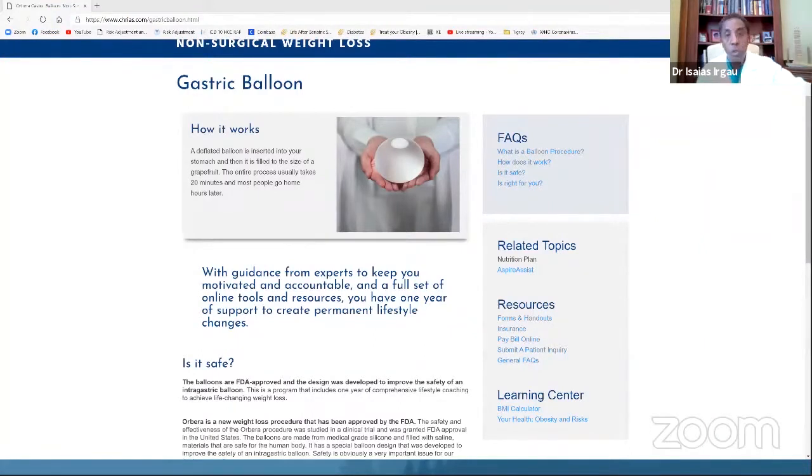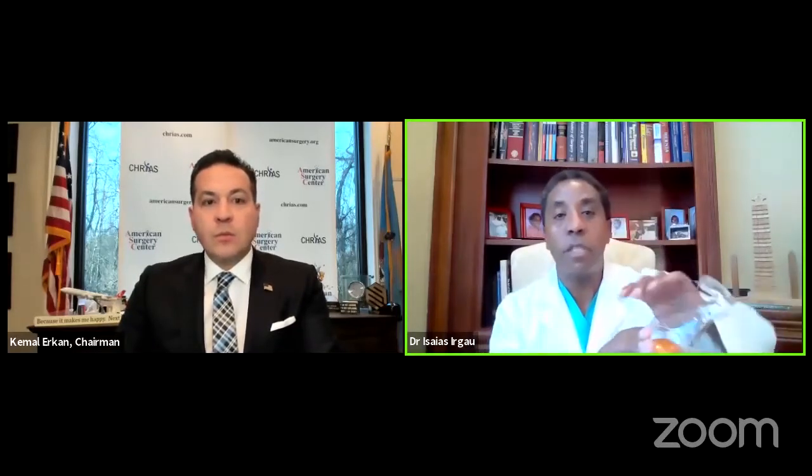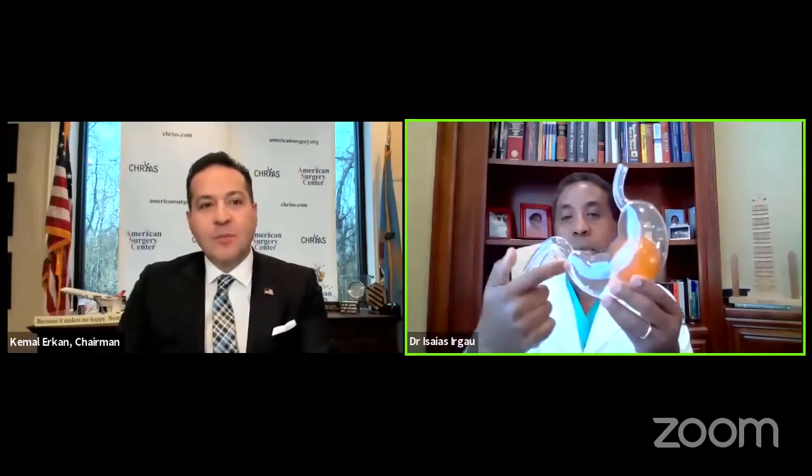I have one sample of the balloon here in my hand. That is actually the Orbera balloon. It's a good size, has some weight, and it enters the stomach deflated. To demonstrate a little bit more, I have this desk model — that would be the food pipe, the intestine, the body of the stomach, and this orange balloon inside it would be the balloon.